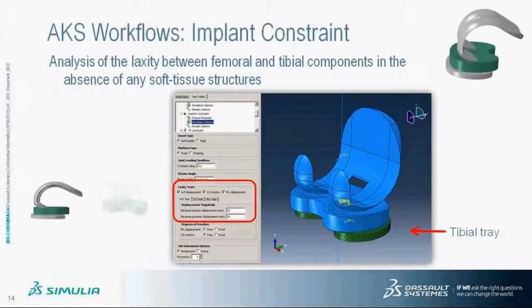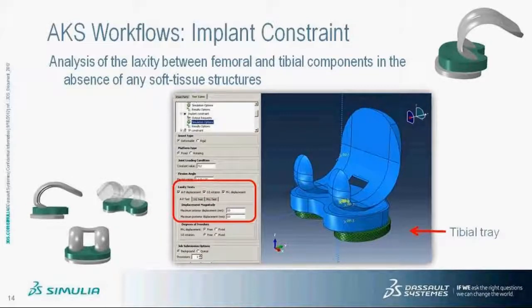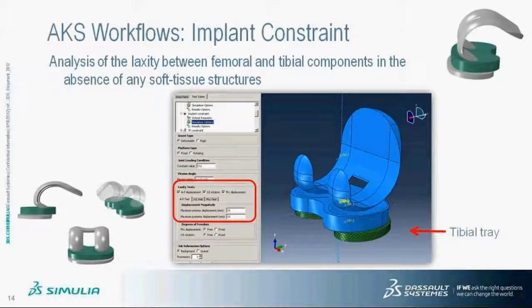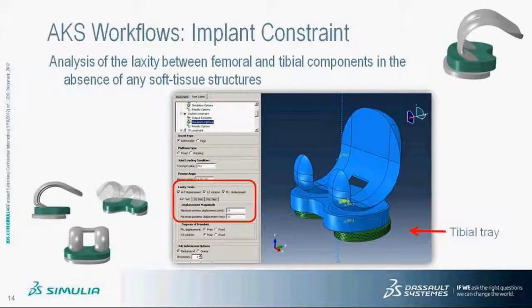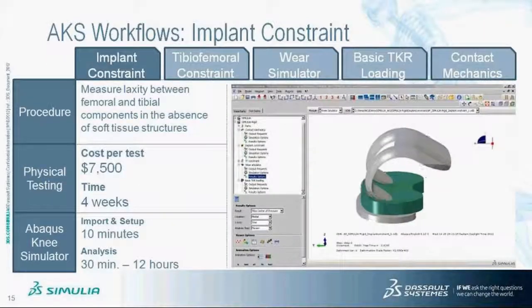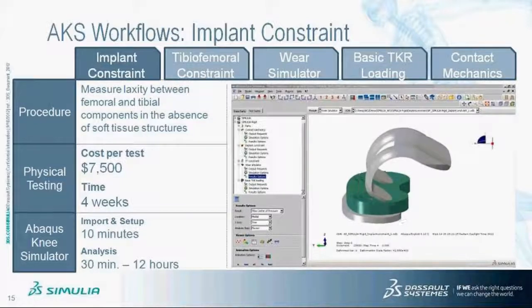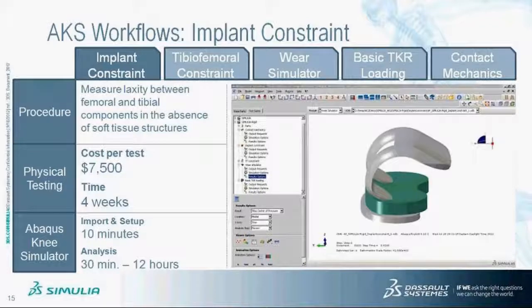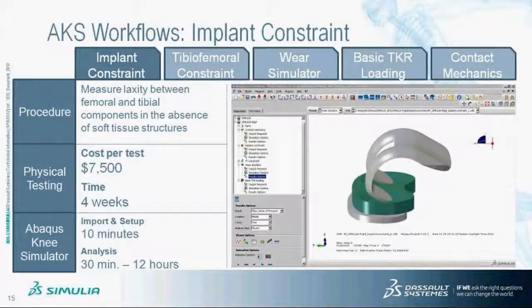Laxity tests provided for this workflow include the anterior-posterior displacement test, the internal-external rotation test, and the medial-lateral displacement test. For each laxity test, the load is applied as a boundary condition rather than a loading condition. The cost for performing a single laxity test physically is around $7,500 and takes roughly four weeks, while running simulations saves significant time and cost.